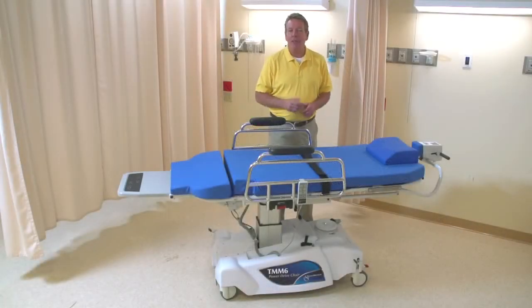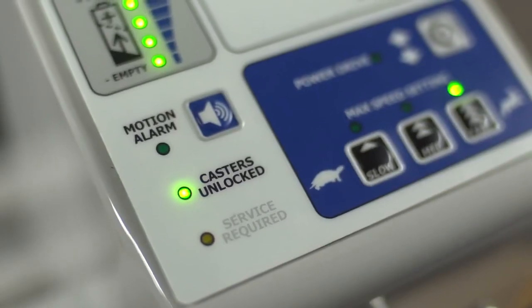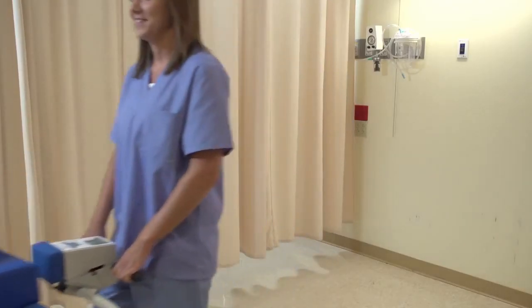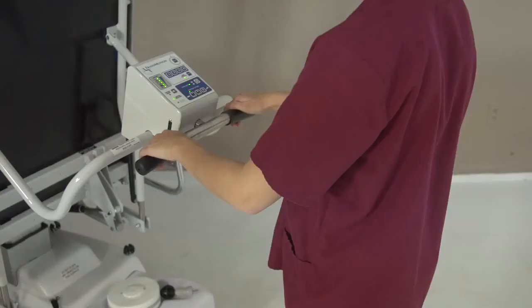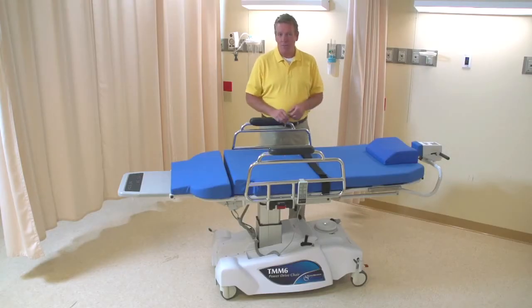Next, check the status of the casters for the power drive to engage. Unlock the casters using the lever at the base of the chair. Now you're good to go. The trigger on the user interface moves the chair forward, up to the maximum speed limit. Release pressure on the trigger and the chair stops. Pulling the trigger puts the chair in reverse. Its speed is also adjustable.